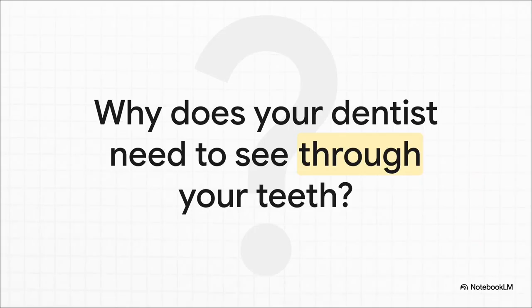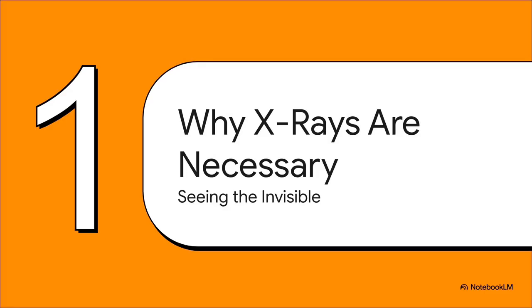And really, it all boils down to this one question. I mean, why can't the dentist just look in there with their little mirror? The thing is, some of the biggest threats to your oral health are completely invisible to the naked eye. They're hiding in places a simple visual check could never, ever find. And that's exactly where dental imaging comes into play.